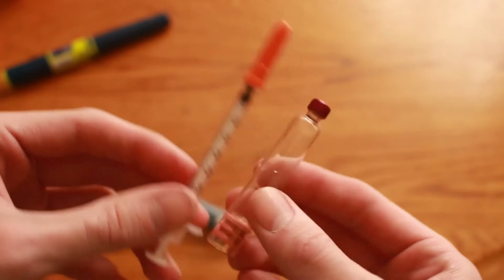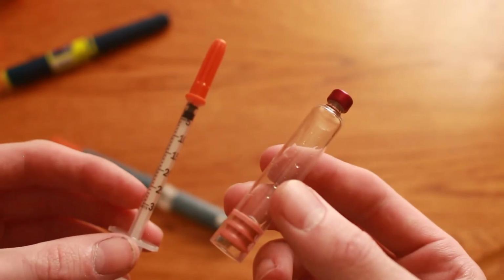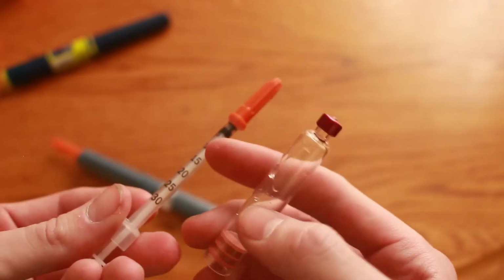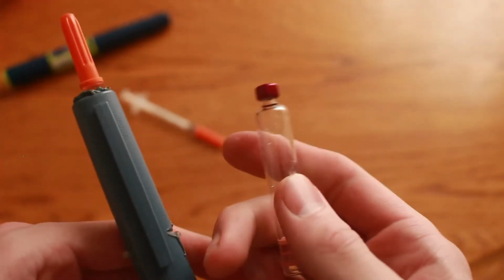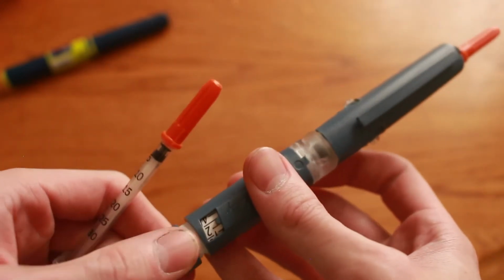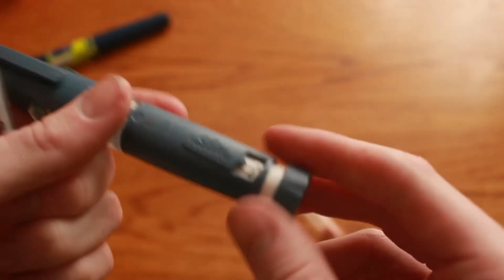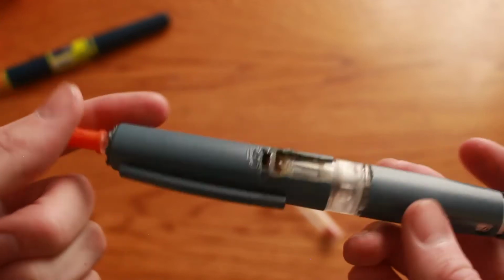This is the same length as this, or just about, very close. And this holds 30 units of insulin, this holds about 300. That means that for the length of this going down, with this going down, is 10 times less, right? Now we got our pen here, calibrated to use this with 1 unit increments. If this is using 1 unit increments to push down on this vial of 300 units, then by the math, every unit of this is 1/10 of a unit in the syringe. That means, yes, you can get 1/10 unit precision with this pen syringe combination.